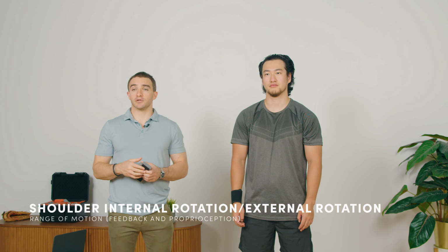In this prac, we're going to be reviewing a variety of different objective measurement techniques that you can use to evaluate and track the physical impairments throughout the course of a shoulder rehabilitation. For this prac session, we're going to use Cal as our patient. Now, Cal sustained a right-sided shoulder injury. The first thing we're going to do is look at range of motion.